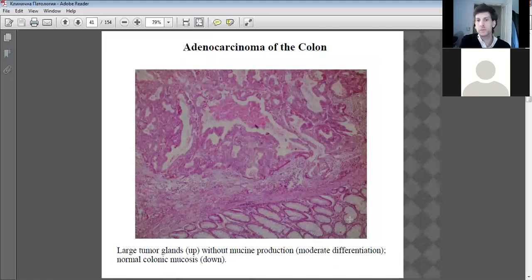Whereas the bottom part is still the normal type of cells, right, with their normal luminal spaces. Right? They'll be producing mucin, mucus, and helping the absorption of water and salts. Eventually, this tumor is going to hit these. It's going to infiltrate these areas.